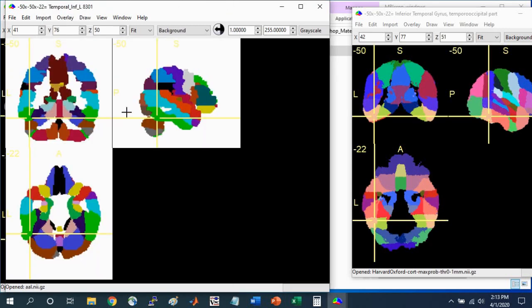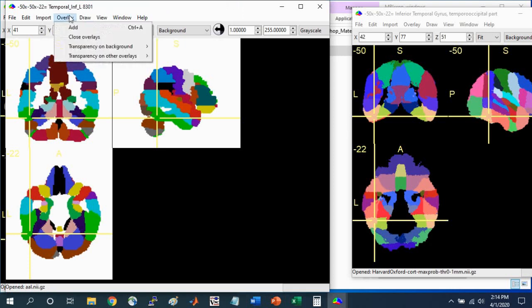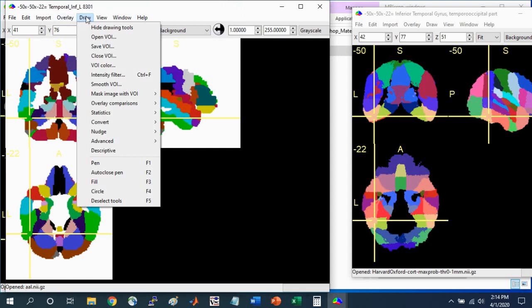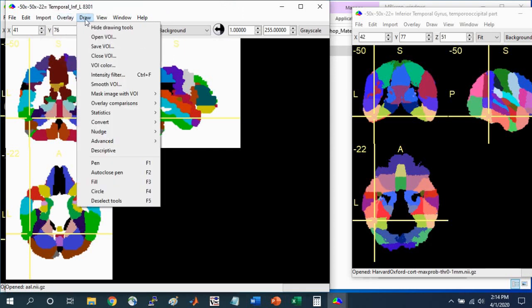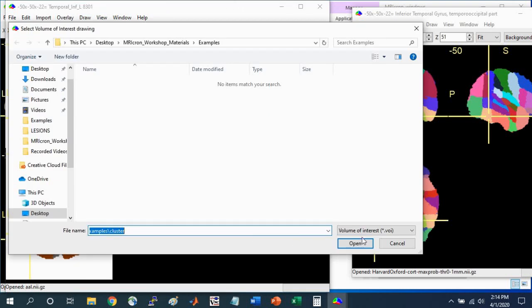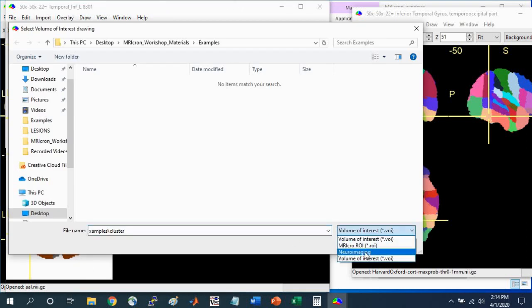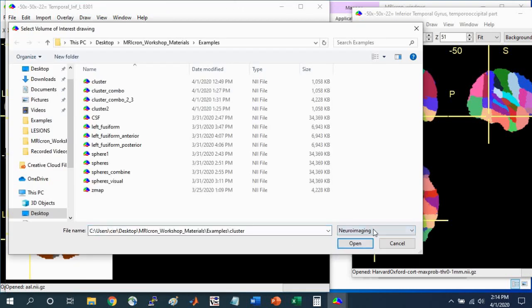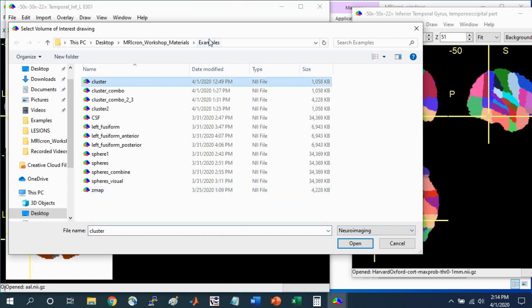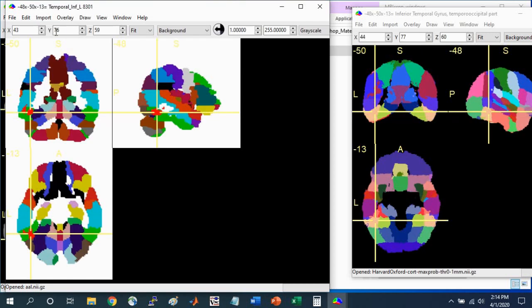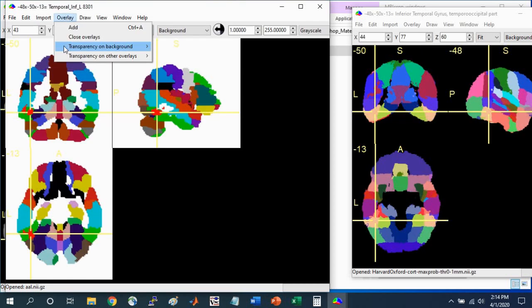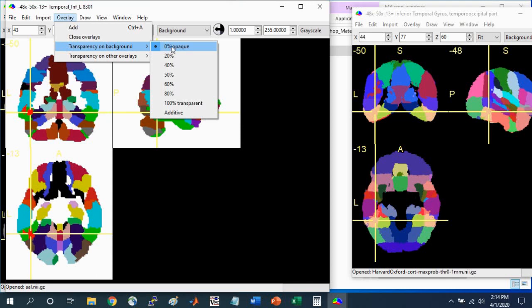Another thing you can do in terms of overlaying a functional cluster on the Atlas is to mask out all of the regions to make it easier to see which parts of the brain are associated with your cluster. To do this, instead of using overlay, go to Draw, Open VOI, and select the neuroimaging format. Select the cluster in our workshop materials example folder. Click Open, and make sure that the Transparency on Background is set to Opaque so you can more clearly see it.